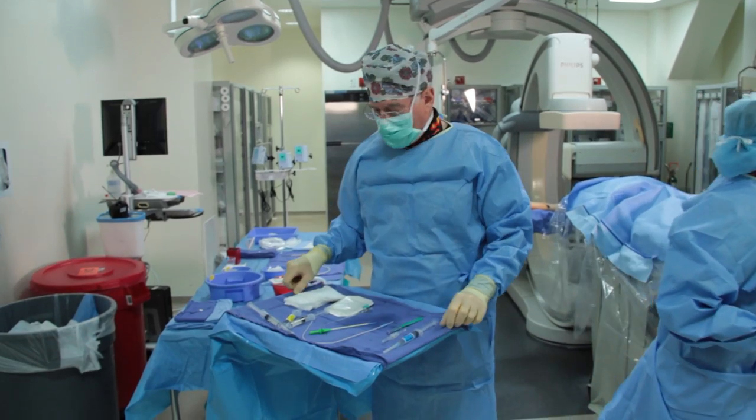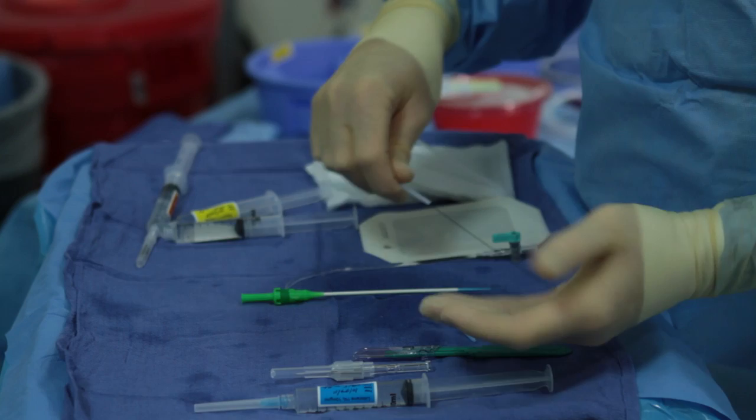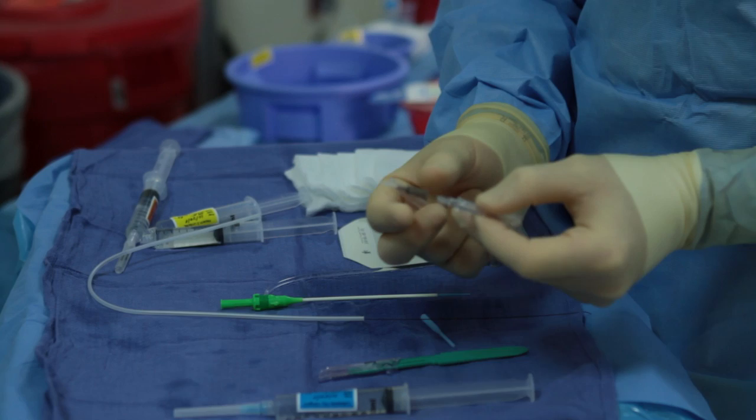I just want to show you the equipment we're going to use for our radial approach. This is a Terumo sheath, its guide wire, micropuncture guide wire, and the two-component Terumo needle, which has the plastic cannula and the needle.